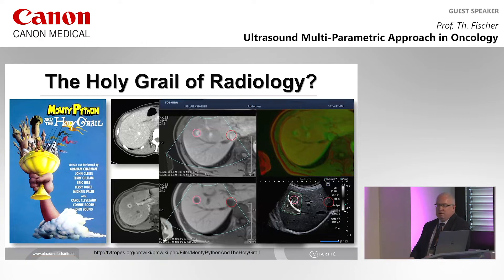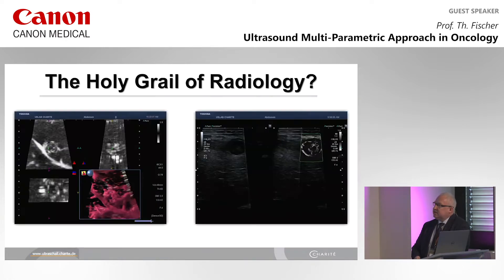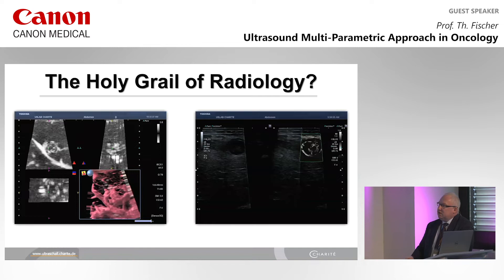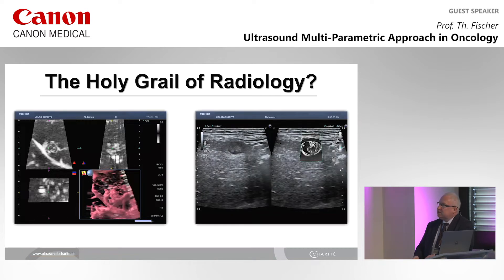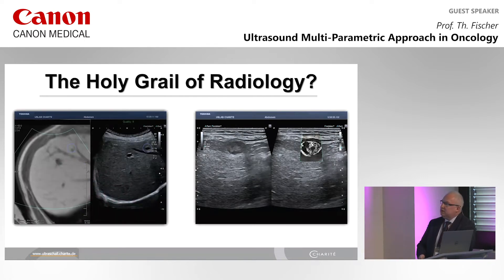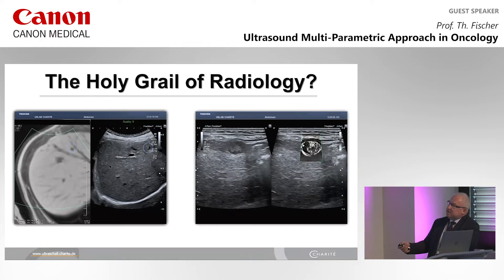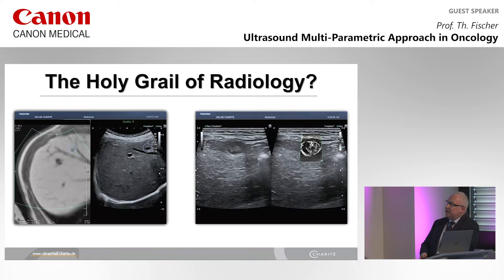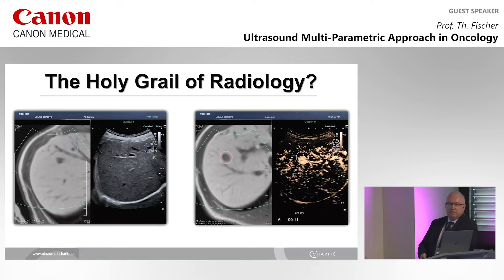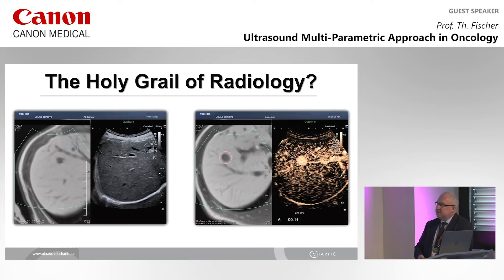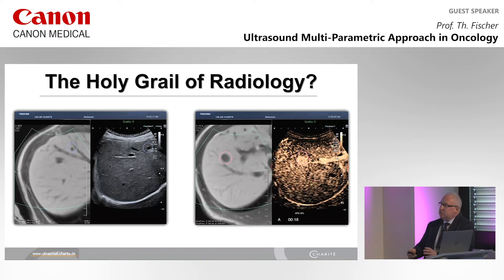This is the quad view, where you can have a marker option in the MR scan in the axial positioning. We can see different sequences, we can have the overlay, and we can have our Doppler possibility. This is an SMI Doppler, and we will understand the highly vascularized nature of the lesion. We can reconstruct the SMI in three dimensions to understand the vascular pattern — highly vascularized, tiny lesion. The second lesion is hypoechoic, highly vascularized with some necrotic portions, suggesting a malignant tumor. We can double-check each finding, for instance this simple cyst of 3 mm. Using fusion imaging in our oncological patients, we see the early contrast inflow — rim-like enhancement — very precise, consistent with a metastasis of a NET tumor.